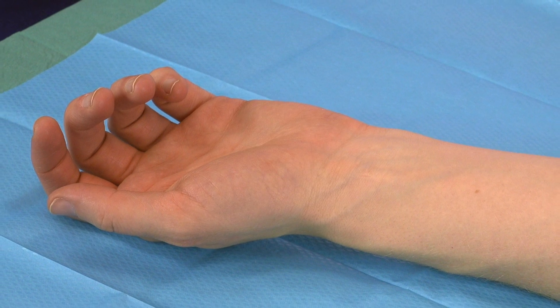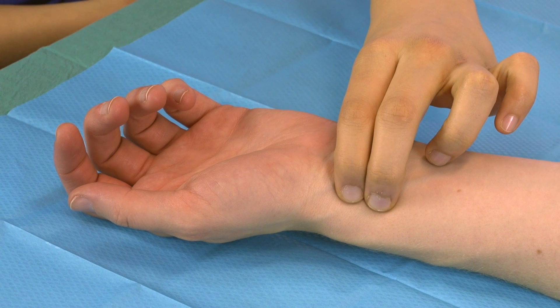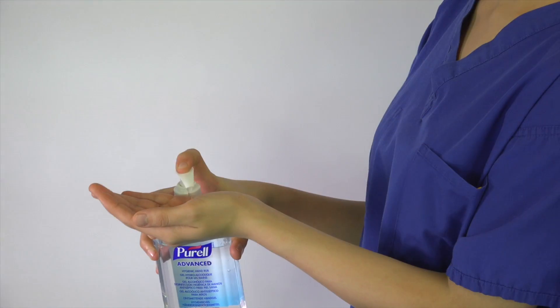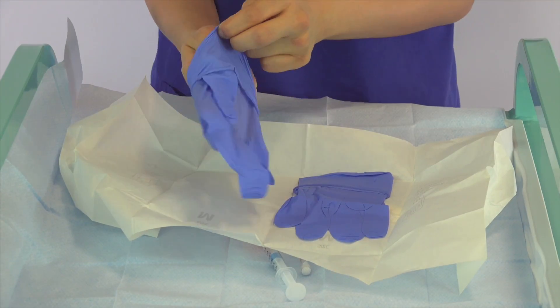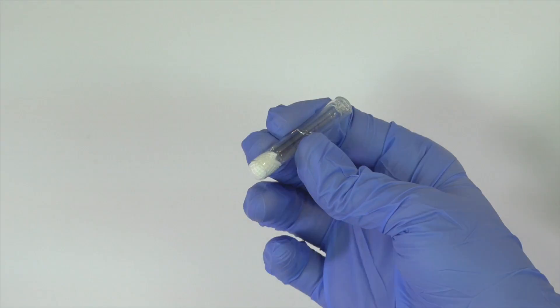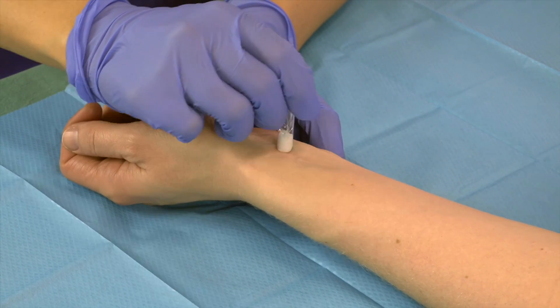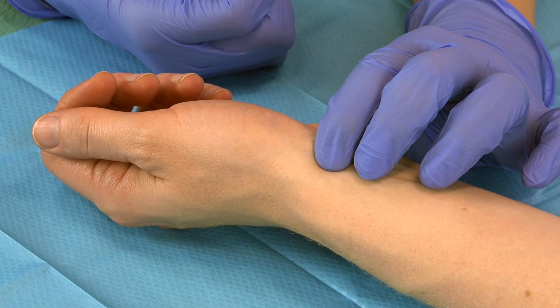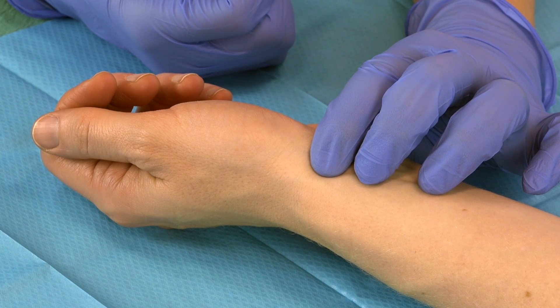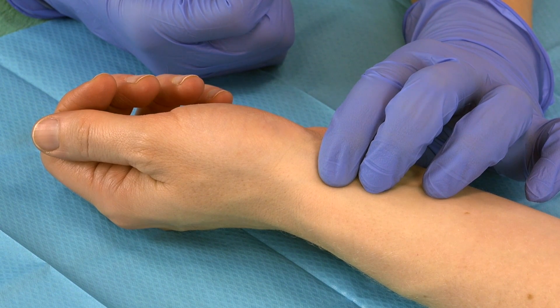Once we are all set up, we position the patient's wrist so that it is slightly extended. This causes the radial artery to sit slightly more superficially, which makes accurately locating it a bit easier. We wash our hands with antimicrobial hand wash or gel, and then put on our gloves. We then clean the area with the antiseptic skin preparation. The radial artery is then palpated to identify the exact point to insert the needle. This part is a really important part of the procedure, as the more accurately you can determine the location of the artery, the better the chance of successfully puncturing it with our first attempt.